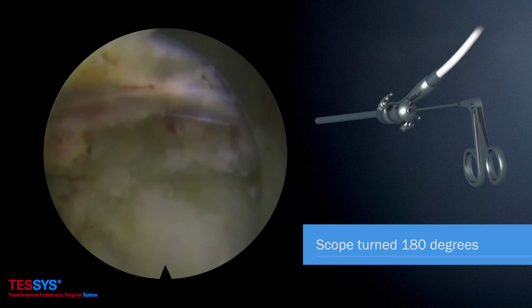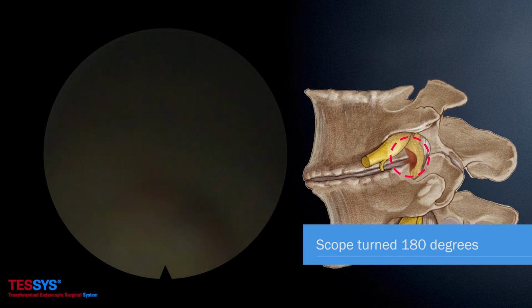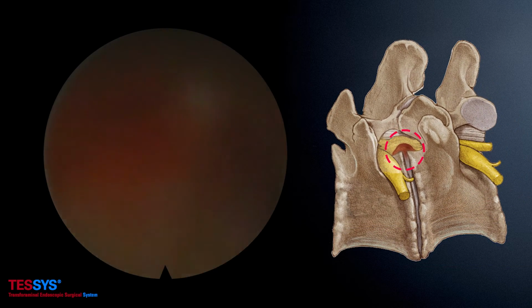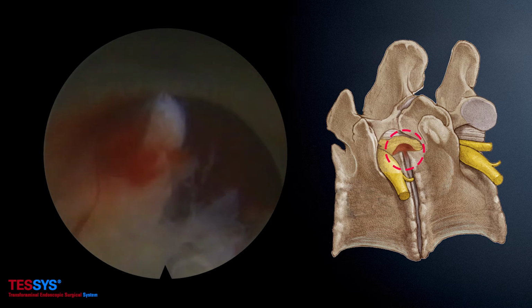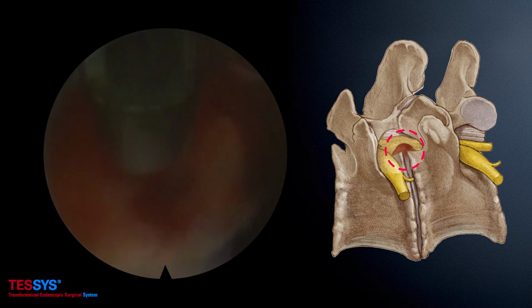The working cannula and the foramenoscope are turned now 180 degrees. On the monitor, the head is now at the left side and the legs are on the right-hand side. The superior articular process is at 12 o'clock and at 6 o'clock and more medial is the direction of the protruding disc or disc herniation.